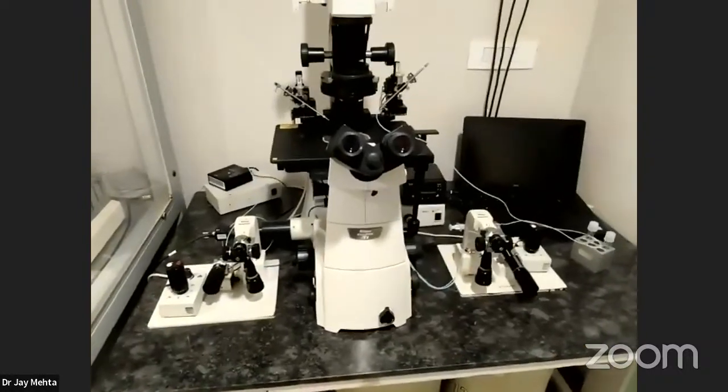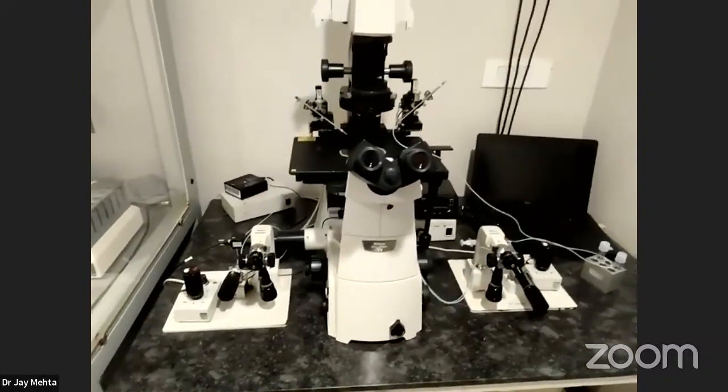When it cannot absorb the gas inside, the pH of the media changes. When the pH of the media changes, then there is a big problem. The embryos will get arrested. Forget fragmentation, the embryo will get arrested.